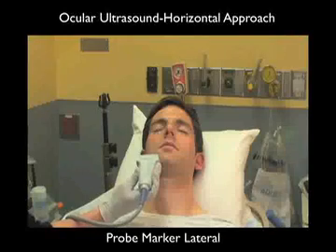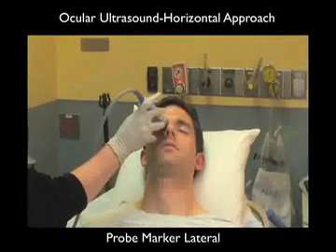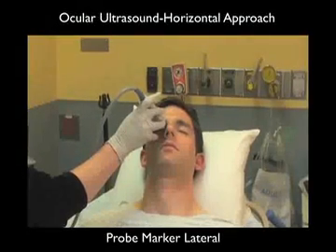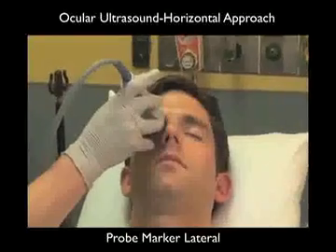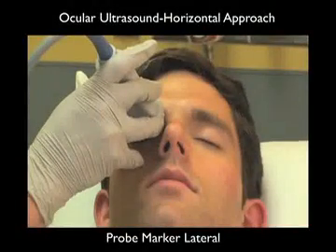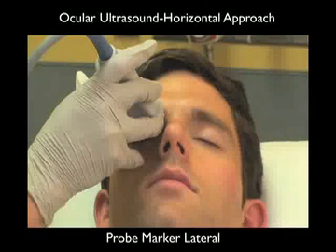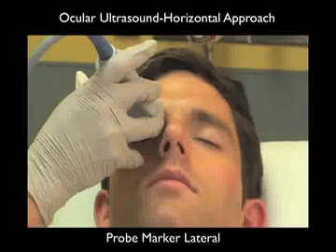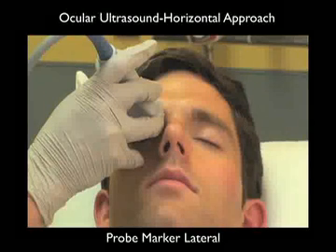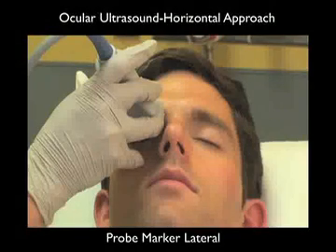Now let's take a look at that same ocular ultrasound approach from a more anterior position. Note again that we're placing the high-frequency linear array probe over the closed eyelid in a side-to-side orientation, with the probe marker oriented laterally towards the outer part of the patient's face. Now remember that if there's any question of trauma or globe rupture, we have to be extremely careful when applying the probe onto the eyelid. In fact, we should be scanning through a copious amount of gel, known as a gel pillow, and really not applying any pressure down to the actual eye.